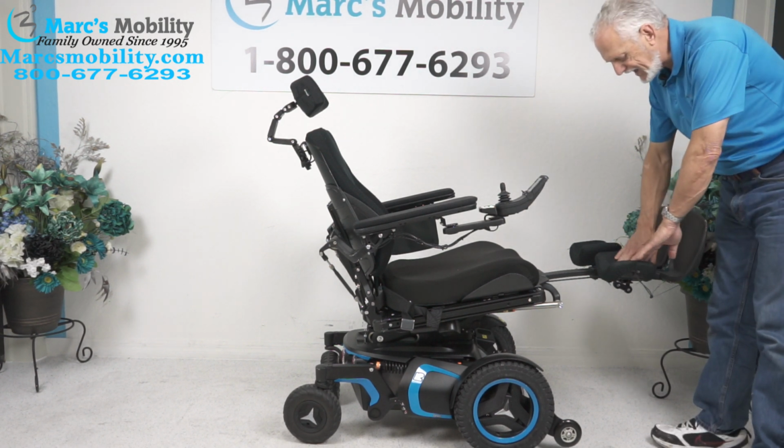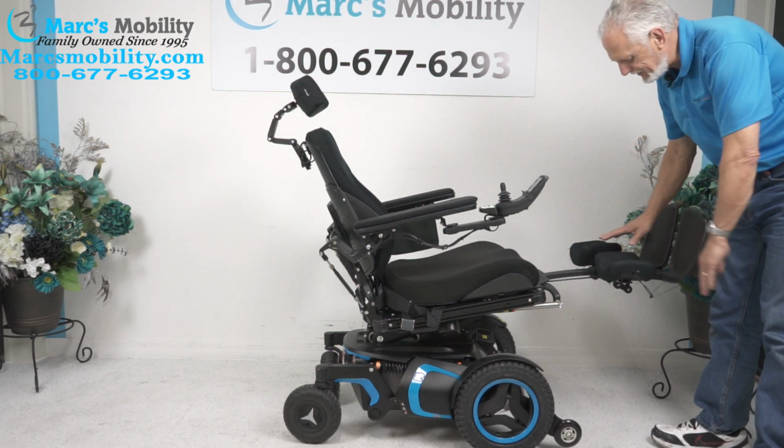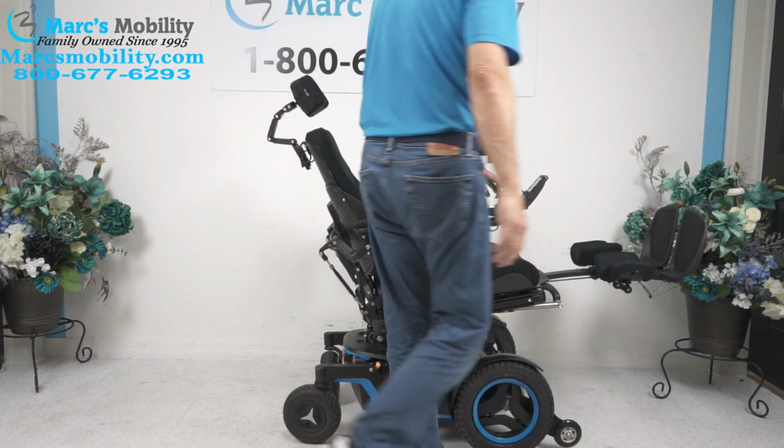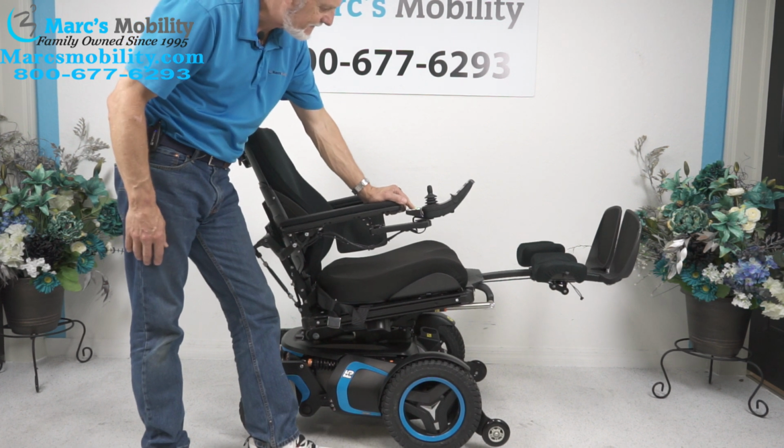These are rounded calf pads. You don't see these too often, okay? So these are rounded calf pads. That's also a custom part for this chair. So I'm going to bring the seat back down to flat.